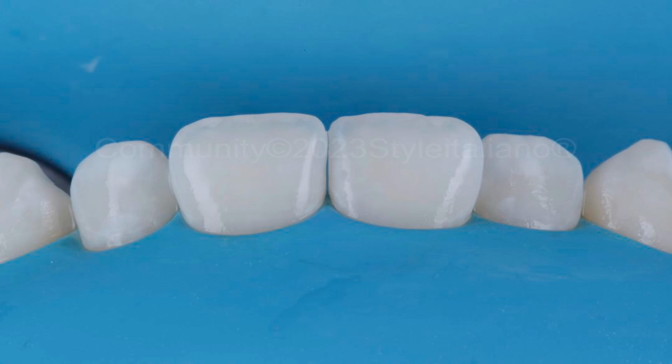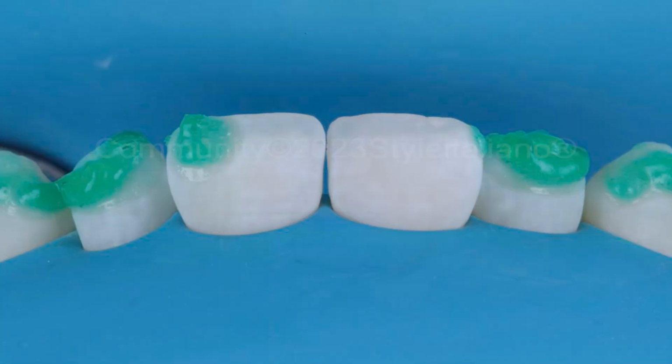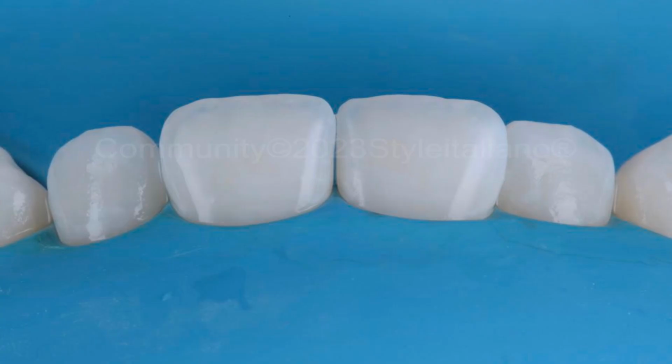Note that the centrals have been masked completely. However, there are still some patches on the lateral and canine. Third cycle with a different etchant on the lesions that require an additional erosive cycle. Final test drive showing complete masking of the previous white spots.